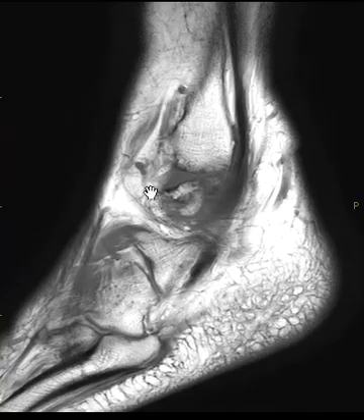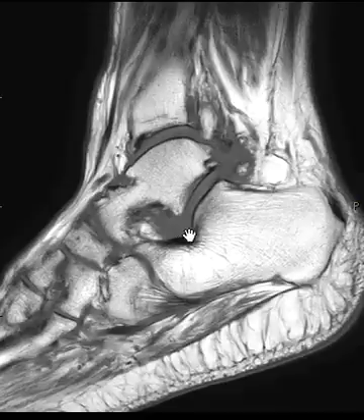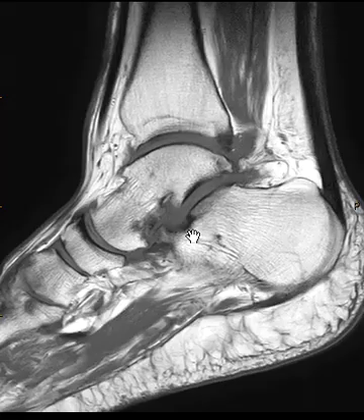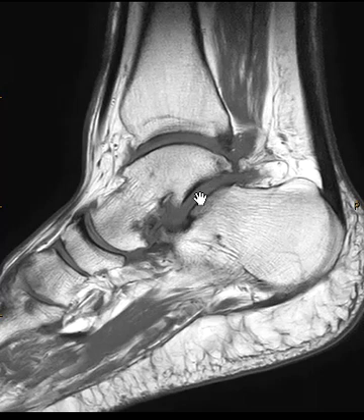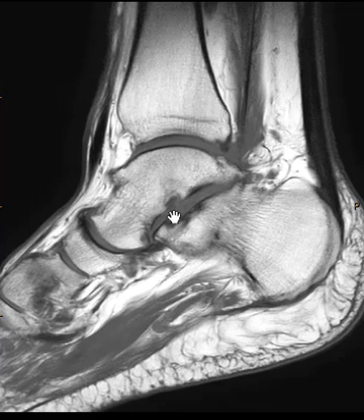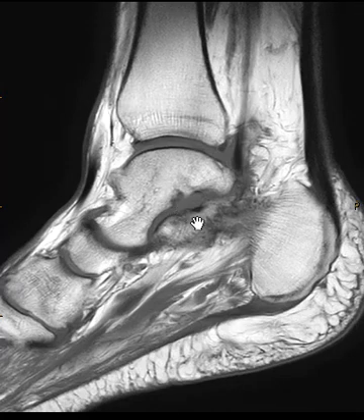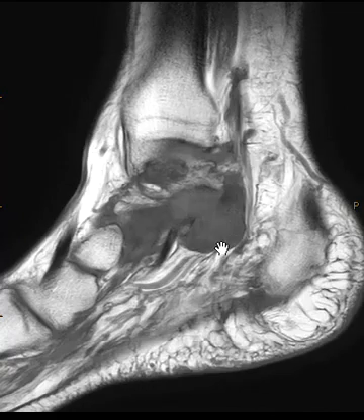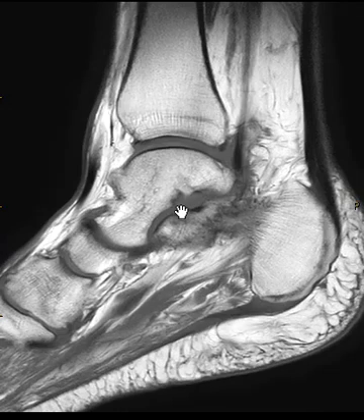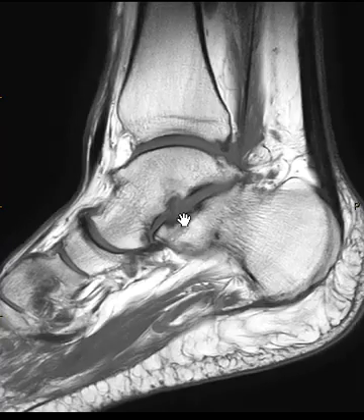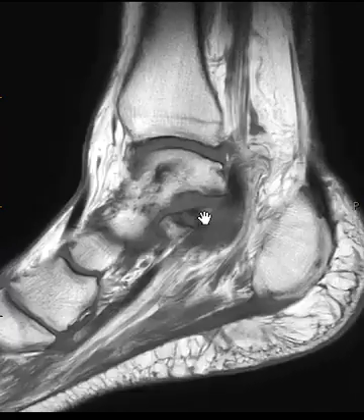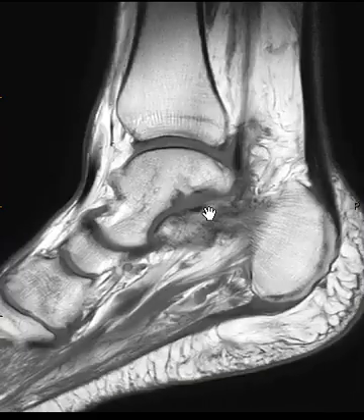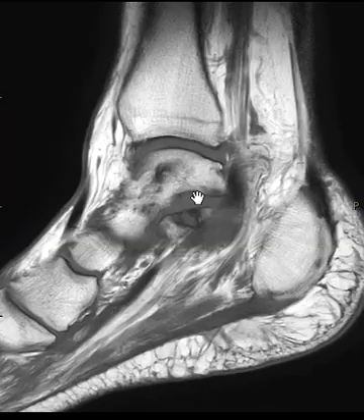Going out laterally, the process extends out but nothing goes into the soft tissues. Moving medially, we see the gray tissue going into the posterior subtalar joint — it's hard to tell if that's just fluid or extension of this process. Continuing medially, we see the gray tissue continue, and then coming out the medial joint we see this big tumor-like component that looks continuous with the inflammation within the sinus tarsi.